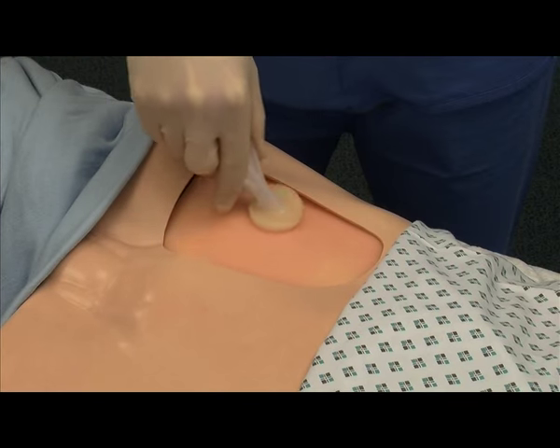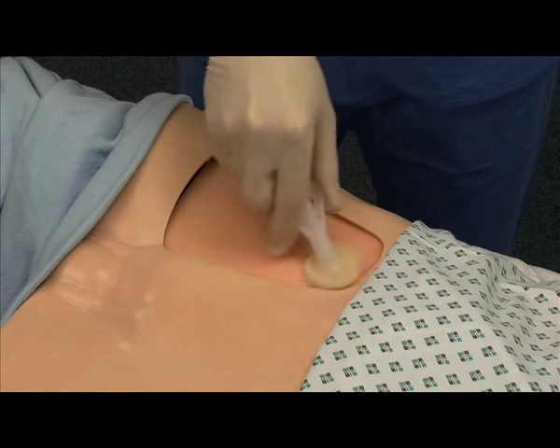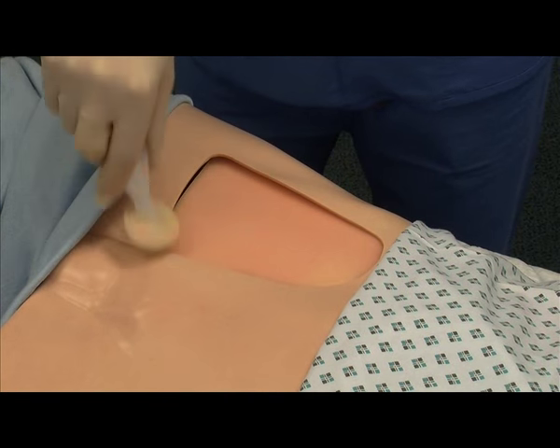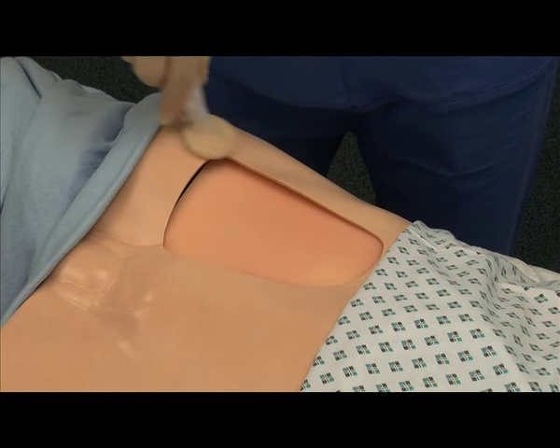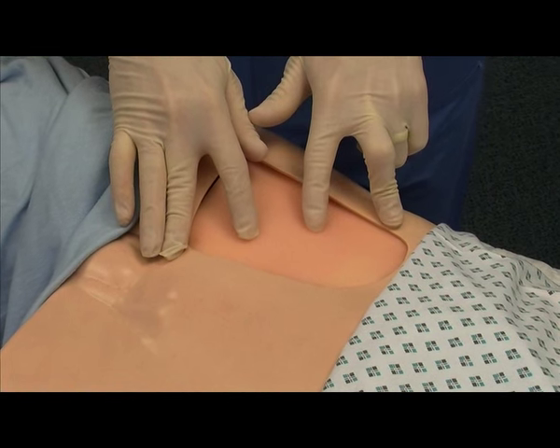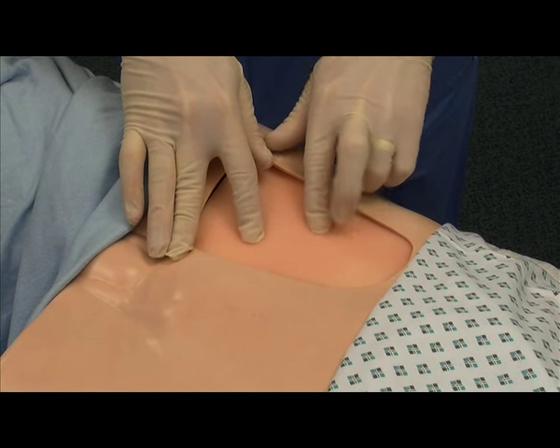Prepare the skin with chlorhexidine 2% and infiltrate the skin and deeper tissues with approximately 5ml of 1% lidocaine local anaesthetic in the awake patient.